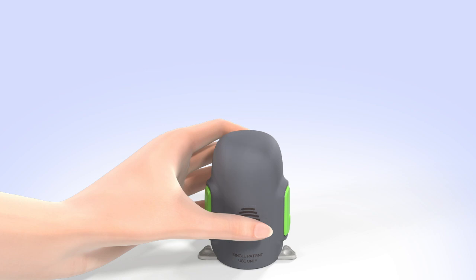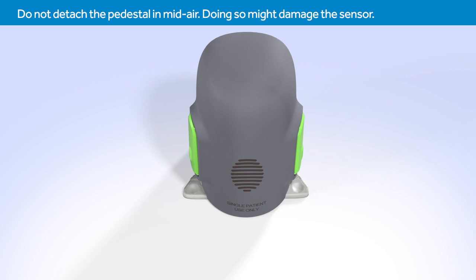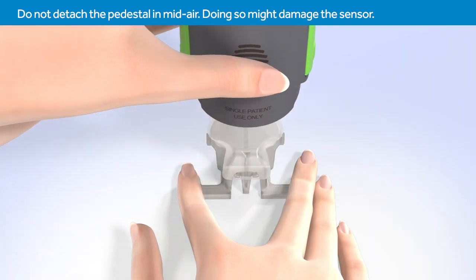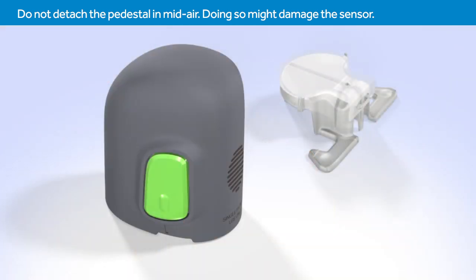Do not push the Serter too hard onto the sensor, as this may cause the sensor to load improperly. To detach the Serter from the pedestal, be sure your thumb is still placed on the thumbprint and you are not touching the buttons. Place two fingers on the pedestal arms, holding it in place, and slowly pull the Serter straight up. After the pedestal is detached, the sensor remains inside the Serter.